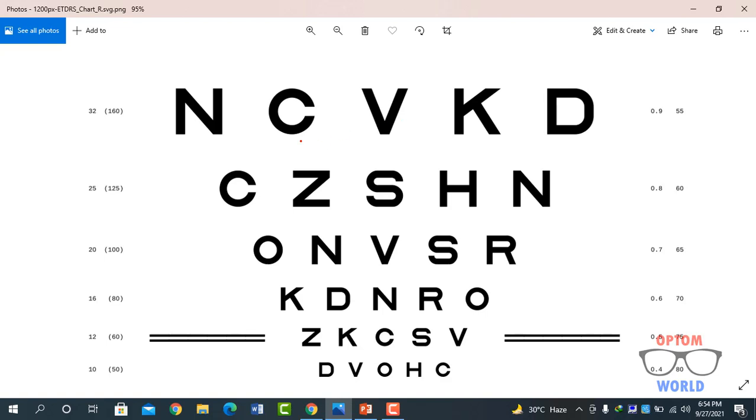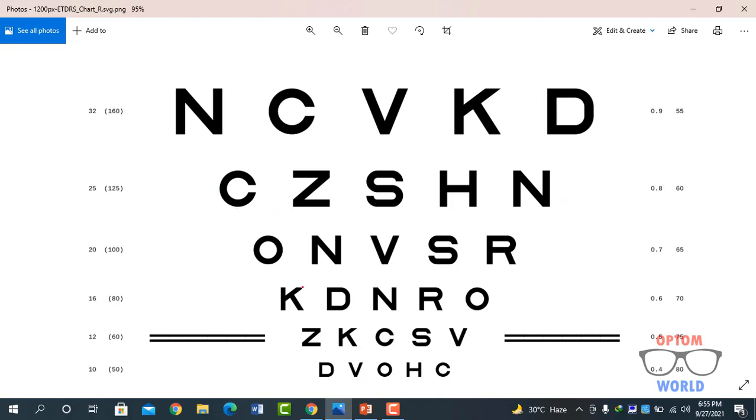Now let's suppose in the left eye he reads this line and then he also reads C and Z and cannot read further words. So in this case where the patient is reading one or two letters, we cannot write 0.8 LogMAR because 0.8 LogMAR is the value when the patient reads all the letters of this line. So we have a case in which patient reads only C and Z. So how to calculate the vision?